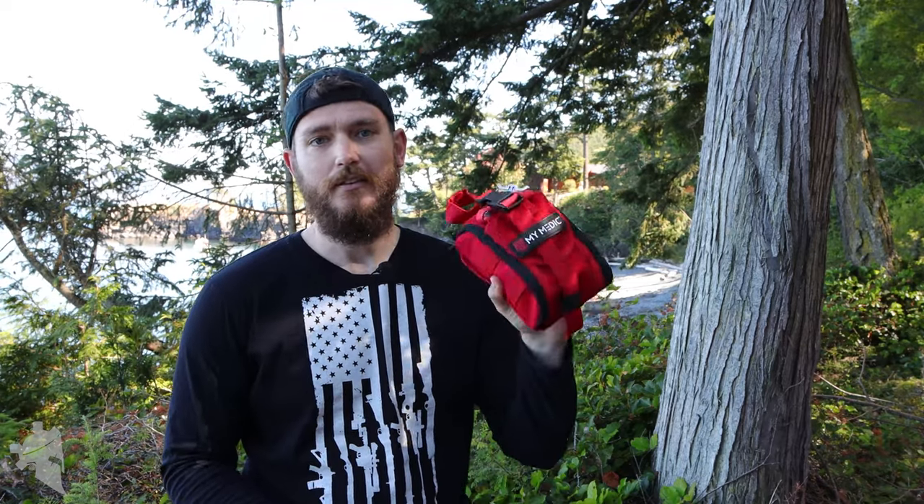This is a purpose-built medical kit for people on shooting ranges and people who are dealing with guns essentially. It's different from a traditional IFAC or Individual First Aid Kit issued by the military, because it covers everything from boo-boos and band-aids to blowouts and serious life-threatening conditions like sucking chest wounds and massive trauma that requires tourniquets.